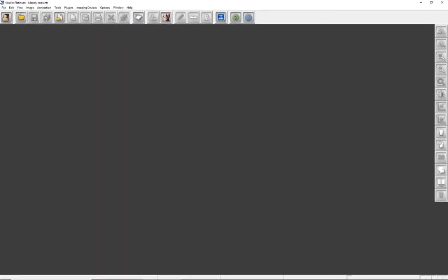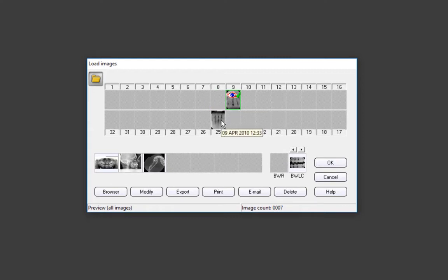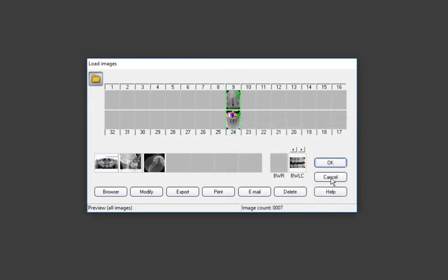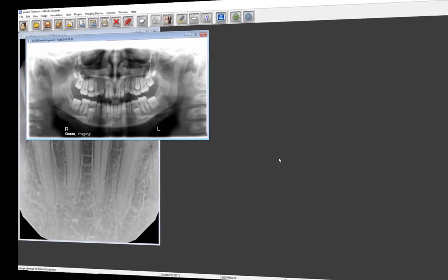Let's return to the Load Images dialog window. When the window opens, you will be in Status View. Images are arranged according to the tooth association the user has entered. The thumbnails of images without tooth associations are displayed in the lower part of the window. The most recent image will appear toward the far left corner of the Load Images window. To change the position of a thumbnail in the mount, drag the thumbnail to the desired position. Notes may be added by right-clicking on an image. To browse through images, select one or more images by clicking on them. Click OK and all selected images will be available for viewing.